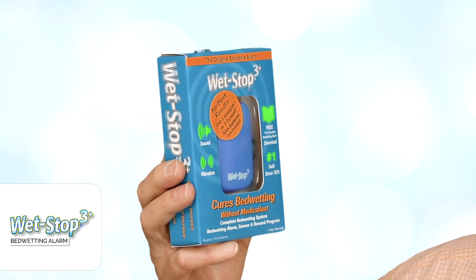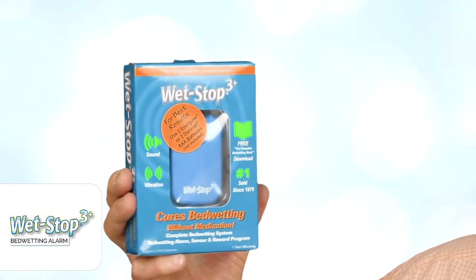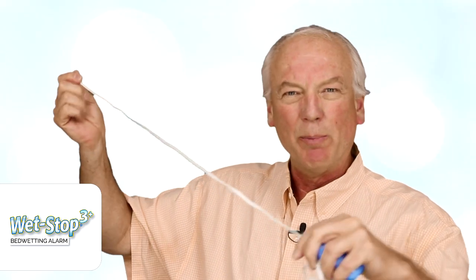Bedwetting alarms are very successful for bedwetting treatment, but they need to be used properly. You can see here that this is the alarm and this is the sensor. One thing you'll notice right off the bat is that the sensor is kind of coiled up. It's been in a box — it's durable, so just give it a little tug and straighten it out.